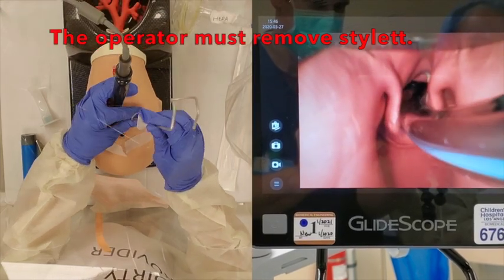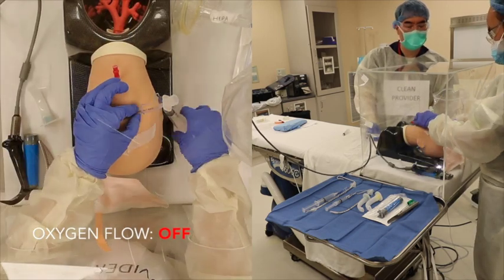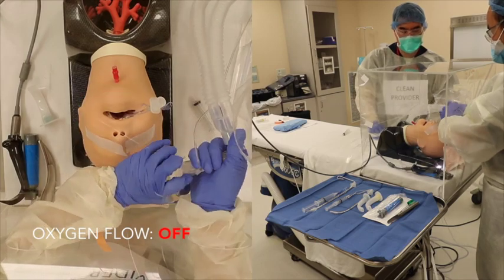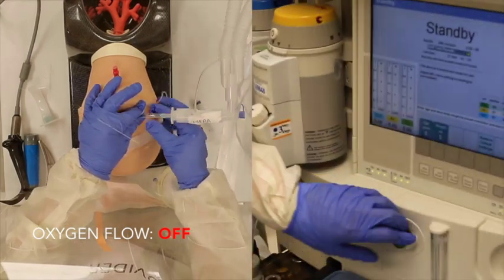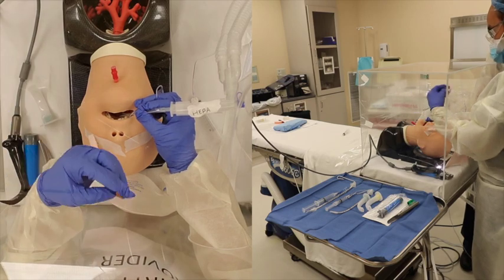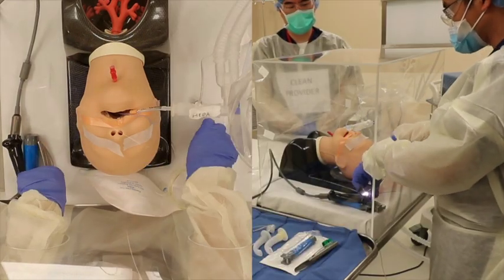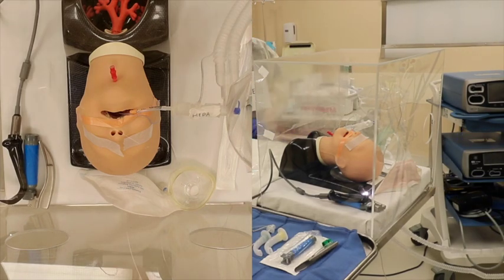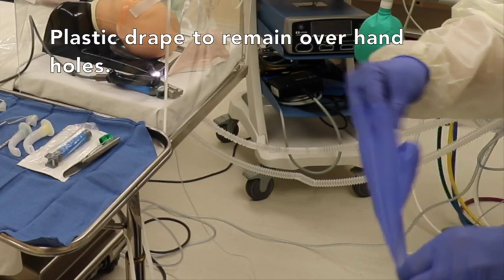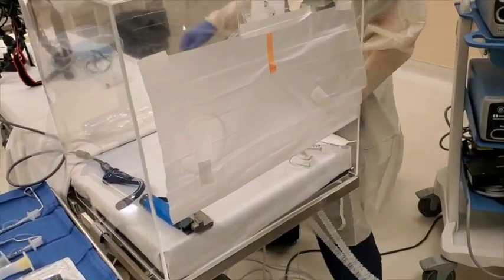Once the cuff is past the cords, remove the stylet. Inflate the endotracheal tube cuff and hook up the anesthesia circuit. The assistant must wait and then be told when to resume gas flow, and will ventilate as instructed by the operator. Once CO2 is confirmed, the operator will tape the endotracheal tube and discard any materials into the Ziploc bags. The operator will then remove upper extremities from the arm insertion points, remove outer gloves or surgical sleeves, and cover the arm holes with the plastic drape.